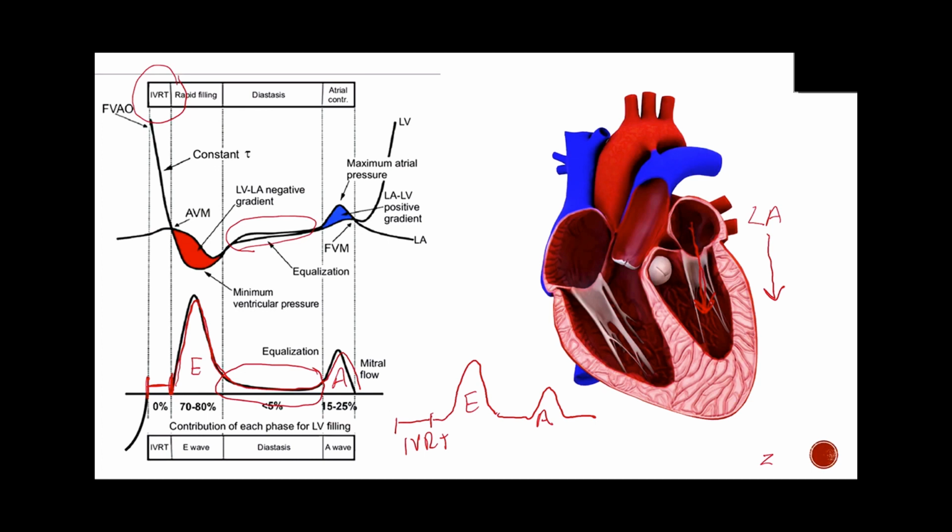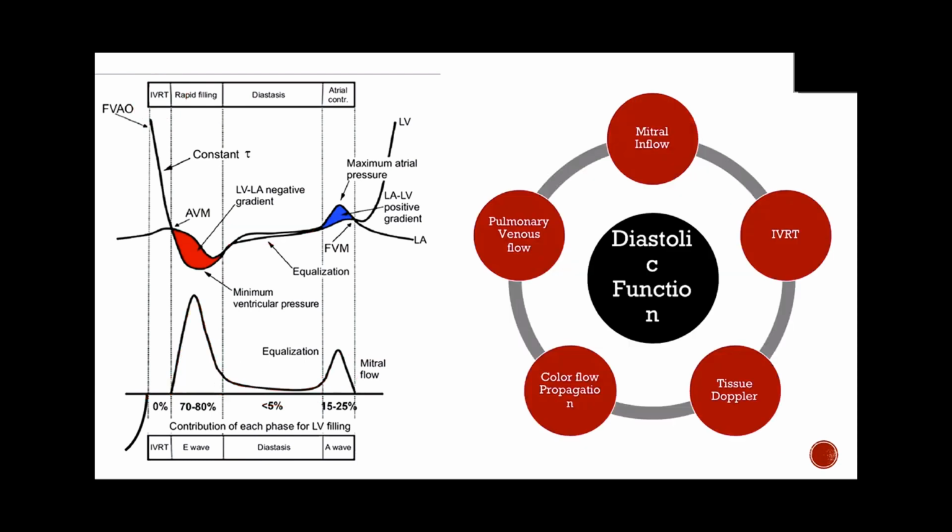So that's why in young, healthy people, you may actually see a very high E wave here, higher than you would expect in a normal, healthy person. Does that make sense to everybody? All right, really important point.